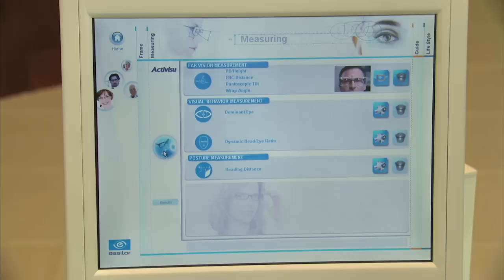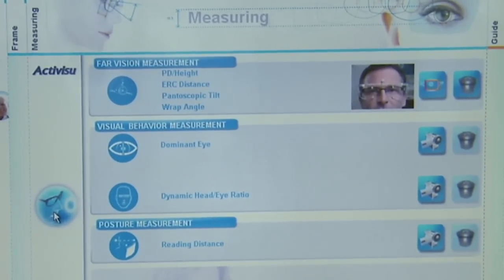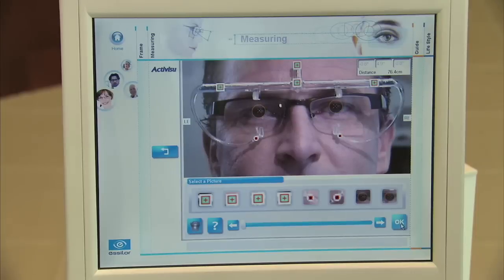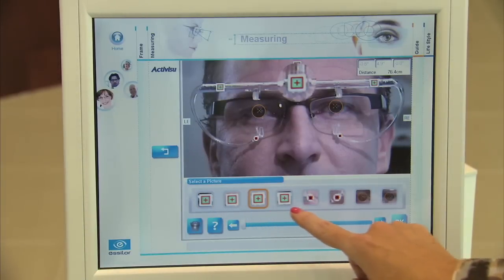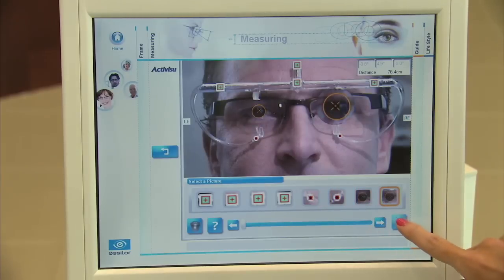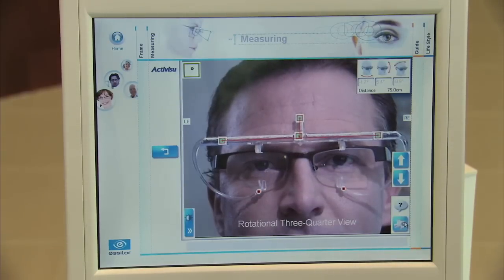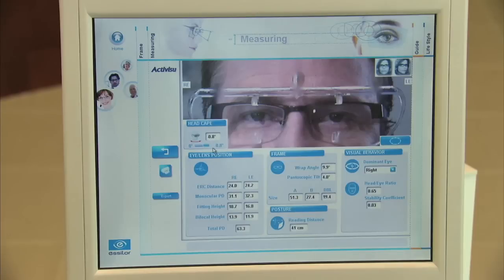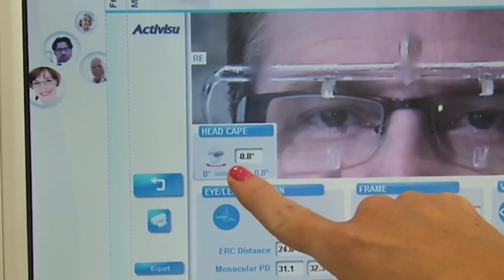This section consists of three measurements: the far-vision measurement, the visual behavior measurements, and the posture measurement. The far-vision measurement will provide all of the needed data for any single vision, bifocal, trifocal, or standard progressive design not requiring additional personalization parameters. The patient's head cape and eye rotation center distance are also captured with this measurement.